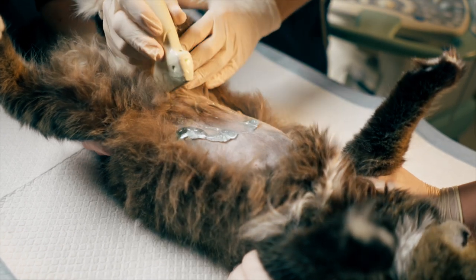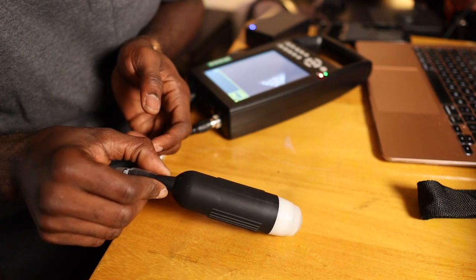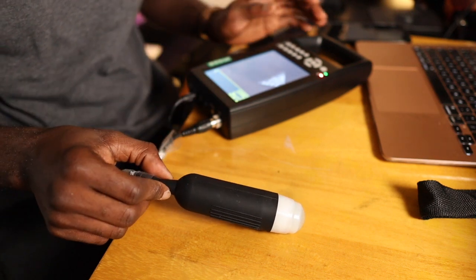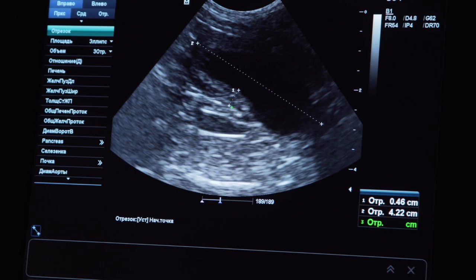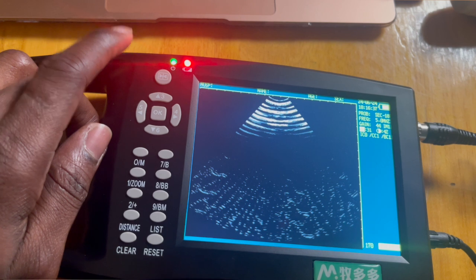When the probe is placed against the animal's body, it emits high-frequency sound into the tissue — you can see how the probe vibrates, it is a gentle vibration. These sound waves are reflected back to the probe, which then interprets the reflected sound waves — the echoes bouncing back from the various internal tissues and structures. This interpretation is displayed as electrical signals on the display unit. You can adjust the frequency, brightness, and contrast for better viewing, and once you have your preferred image, you can freeze it by pressing the freeze button.